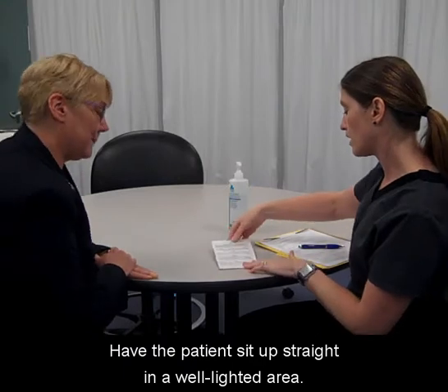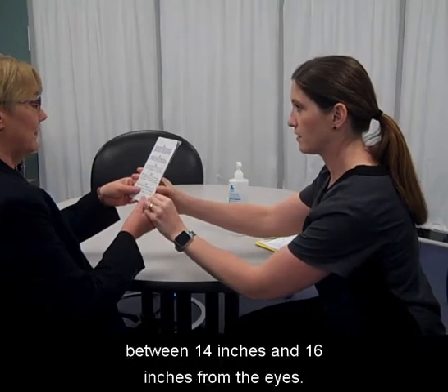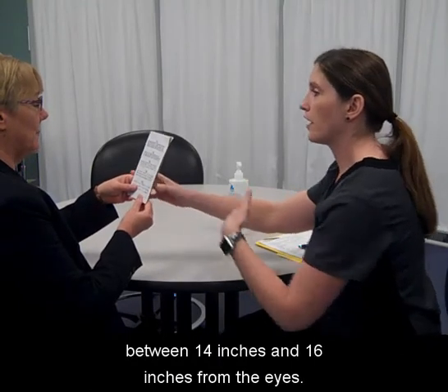Wash your hands. Have the patient sit up straight in a well-lighted area. Hand the Jaeger chart to the patient to hold between 14 inches and 16 inches from the eye.